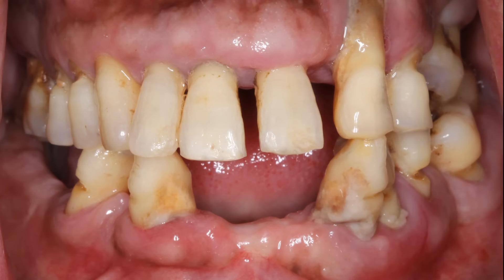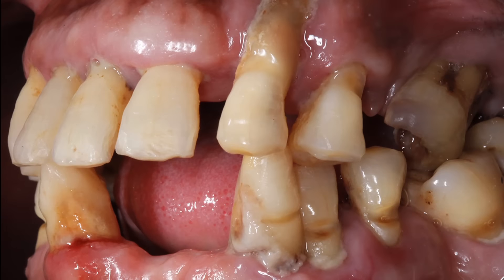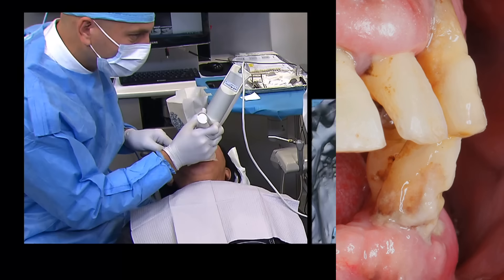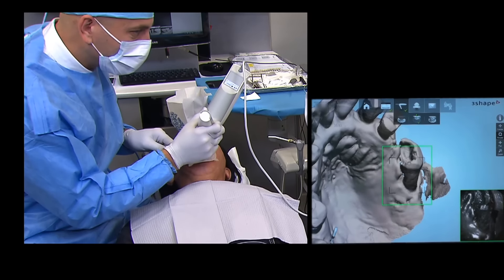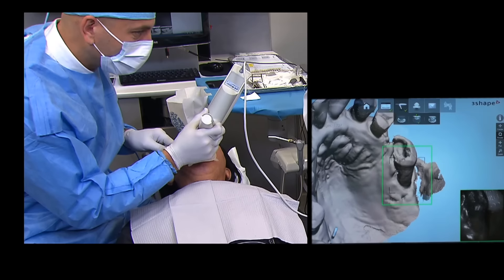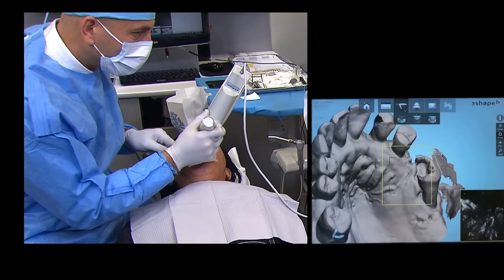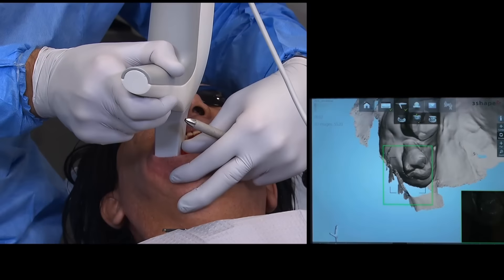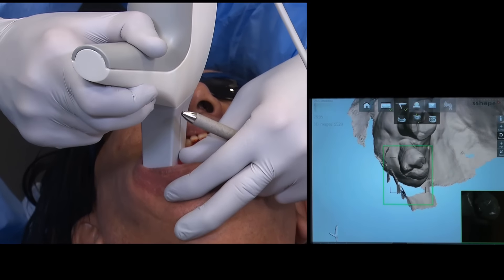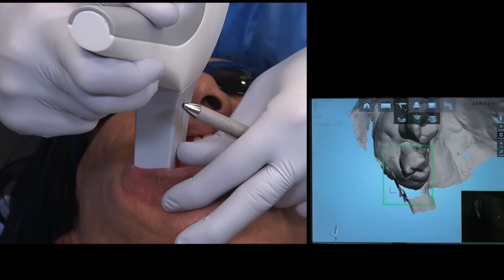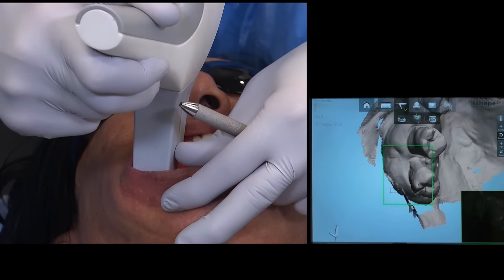As you can see in these pre-op pictures, the patient presents with very poor oral hygiene. The patient is diagnosed with generalized chronic periodontitis. I brought him in wanting to showcase a digital impression for his initial impression making, because with a regular alginate impression the teeth are at risk of being extracted at the time of impression making.